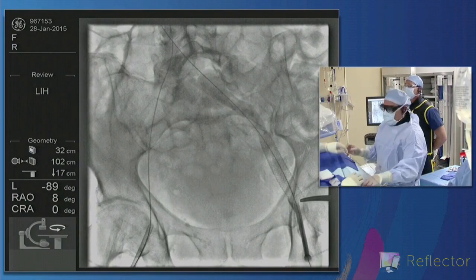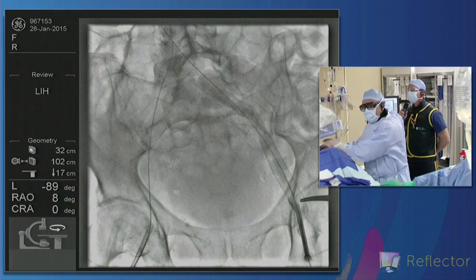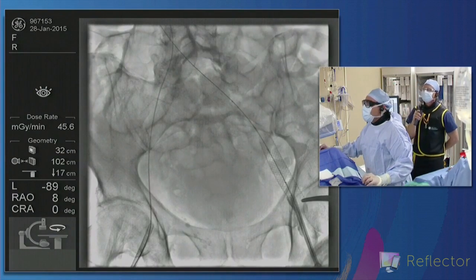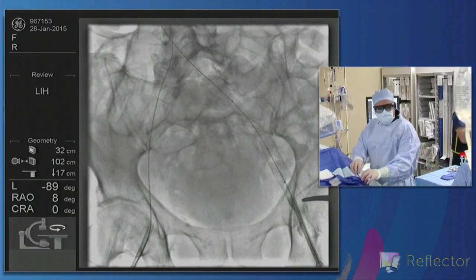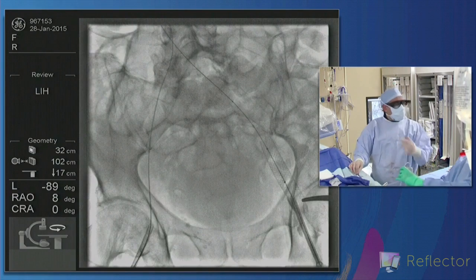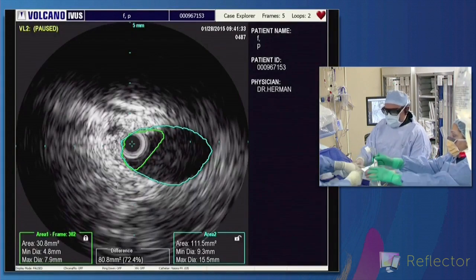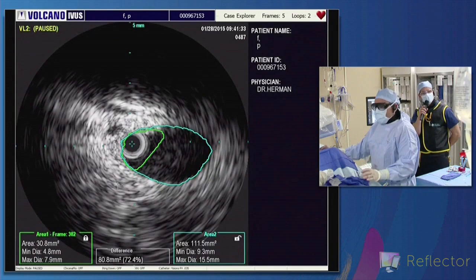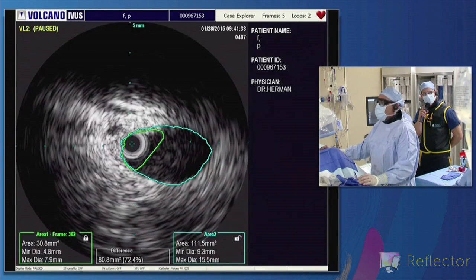Gary, how low are you comfortable bringing stents? Looks pretty good, great. To confirm. And John, I'm thinking maybe he's got the other side to do, but if this IVUS looks good, you guys want to do another presentation, and we have, I believe, until 9:30 our time. We have a preloaded prior PE case, so if we have time, maybe we can get through that.